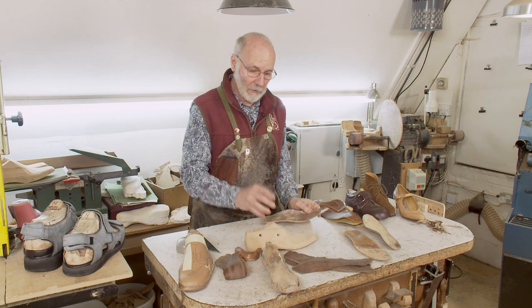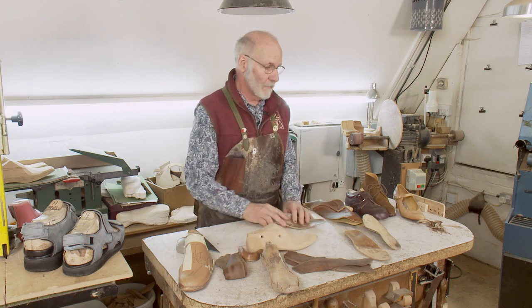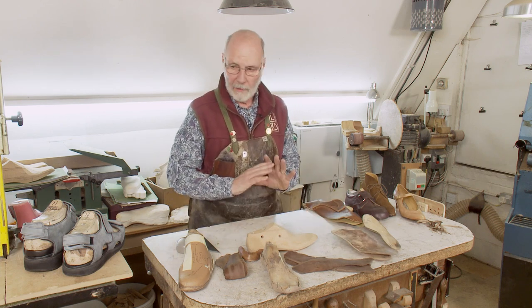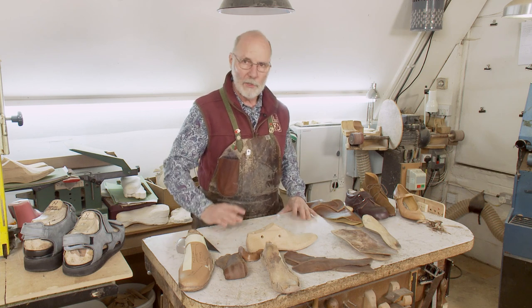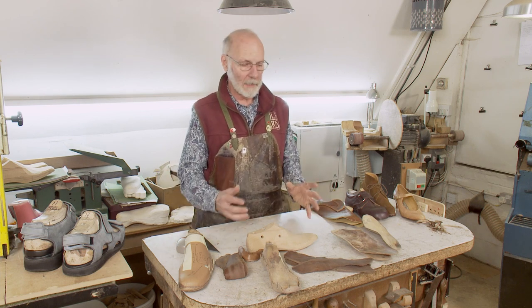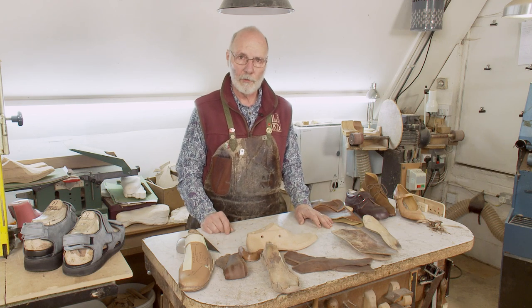So those are three elements — the insole, the stiffener, and the toe puff — that people know very little about. They probably don't even realize they exist, but they are hugely significant when writing and making the prescription for bespoke orthopedic footwear.